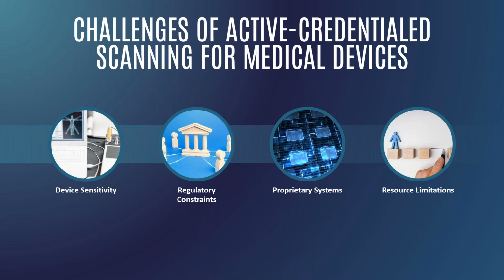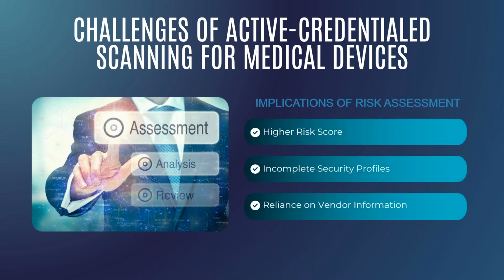It's being pushed, but what we have to understand is, if we have to do passive scanning, how do we implement better security on that? Next one. The problem is, if you can't do active and you have passive, it will increase the risk score of your risk assessment, because you're relying more on the vendor and you're not getting all the information immediately. So a lot of times you're going to miss vulnerabilities, maybe.